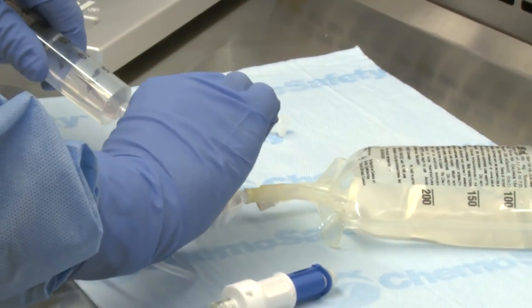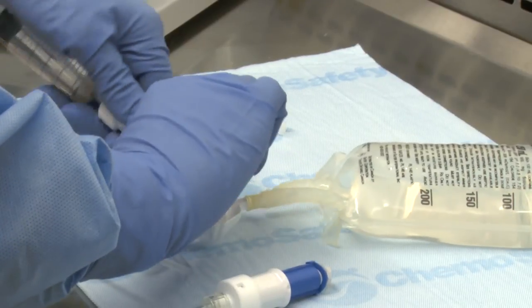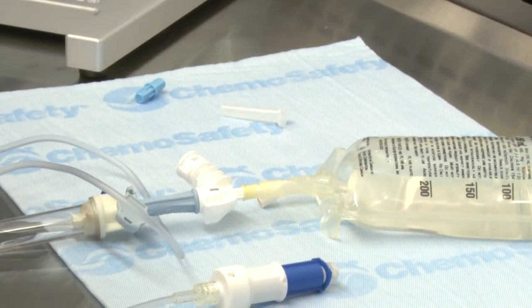Finally, disengage the syringe unit from the infusion adapter using the pull-turn-pull technique. Repeat the steps if additional syringe units are required for dose preparation. The IV bag is now ready for IV administration.